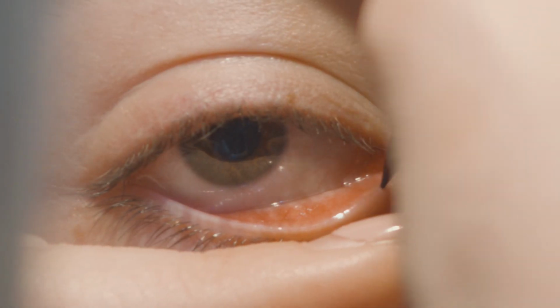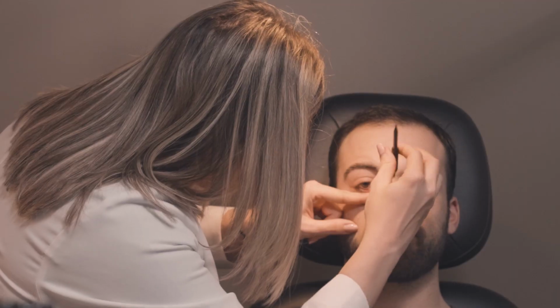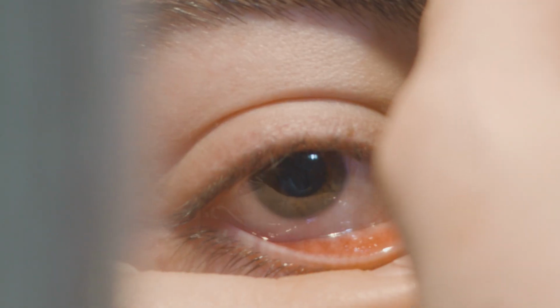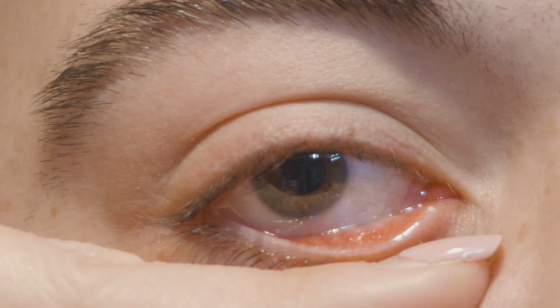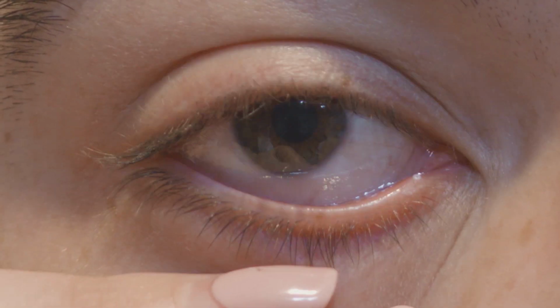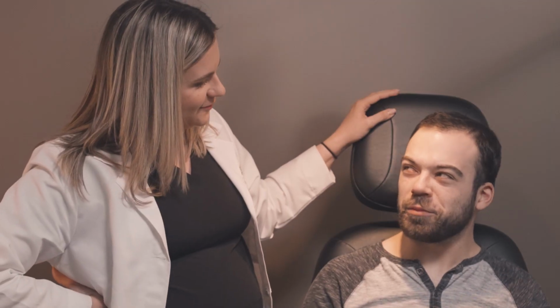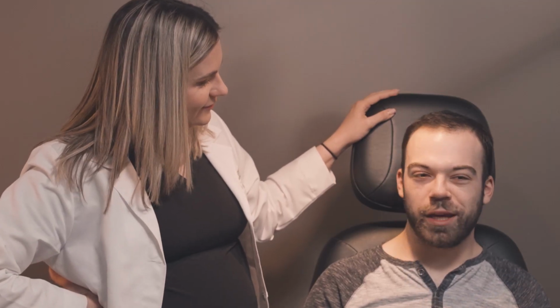I'm gonna re-dilate that a little bit more. And we'll switch to the plug side. And release. And you can see that little white dot is the punctal plug. How's it feeling? Not bad at all. Felt a little bit of pressure when it was going in, but aside from that, no worries.